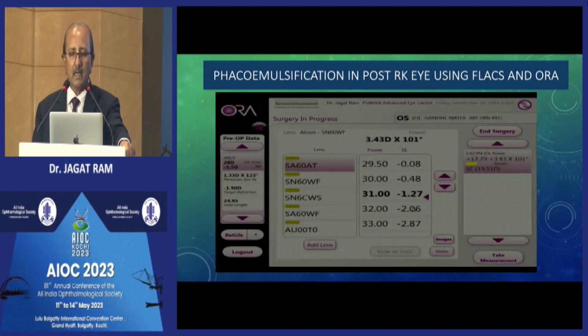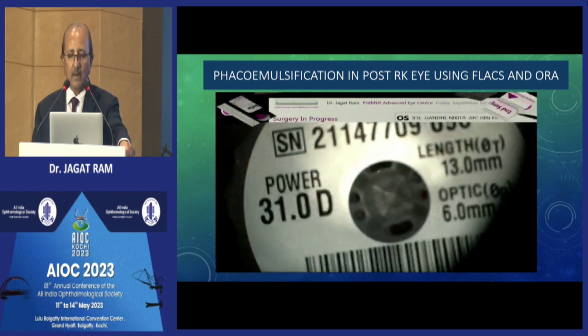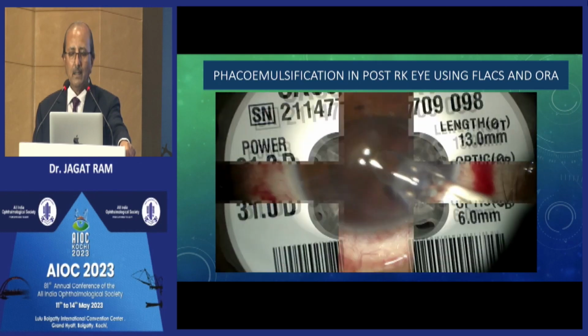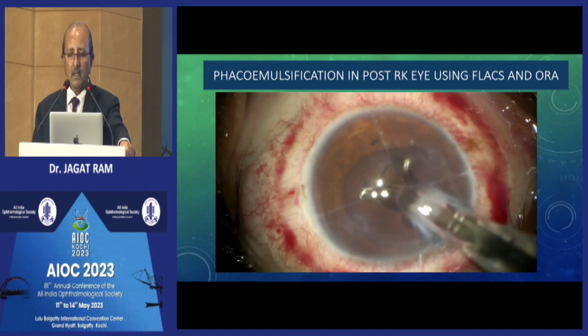Fixation is extremely important, and here it shows 31 diopter power. So more than 30 diopter comes in only a few of the IOLs.